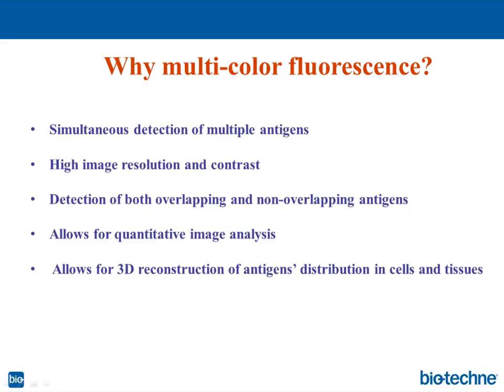detection. But unfortunately, if we combine two chromogenic techniques using, for example, HRP substrates and alkaline phosphatase substrates, these targets ideally need to be localized to different compartments of the cell. So we call them non-overlapping, because if they overlap, it will be hard for us to analyze the expression of each antigen in particular, because they may mask each other.